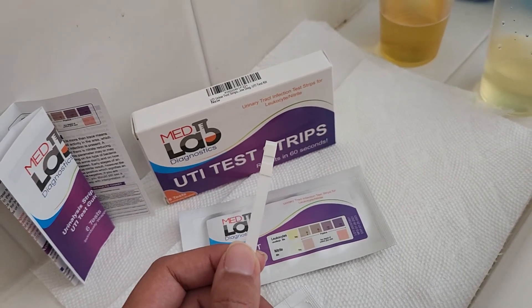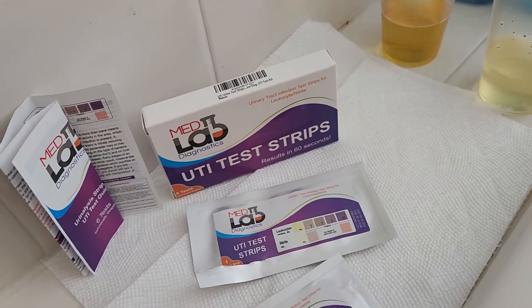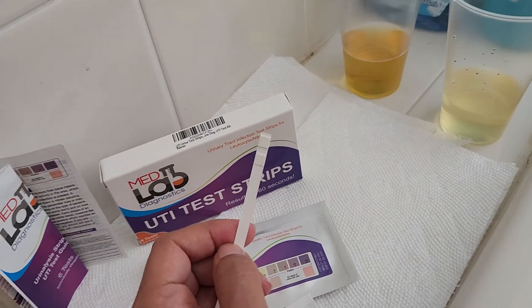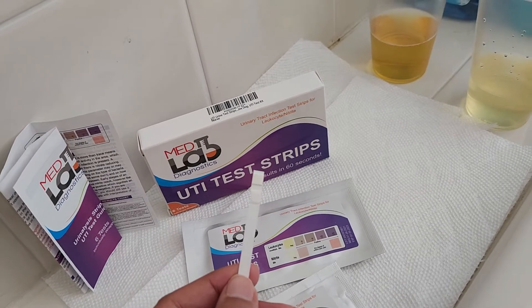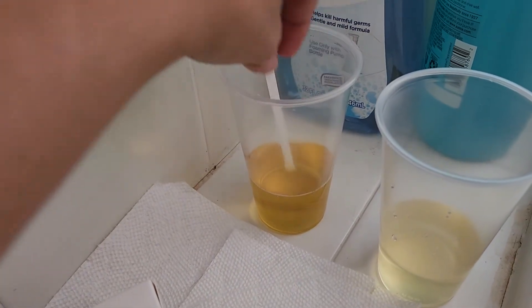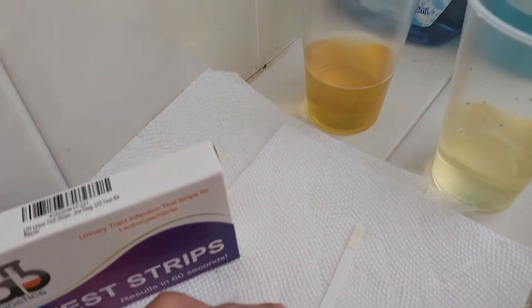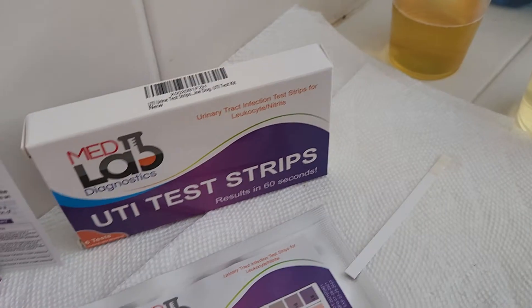If you see any sort of purple color on the strip when you first take it out of a brand new pack, then that means the strip has gone bad and you need to get new strips. So just check to make sure it's white before you start, and then we're going to go ahead and dip the first urine and lay it down. You get the results for this in 60 seconds.